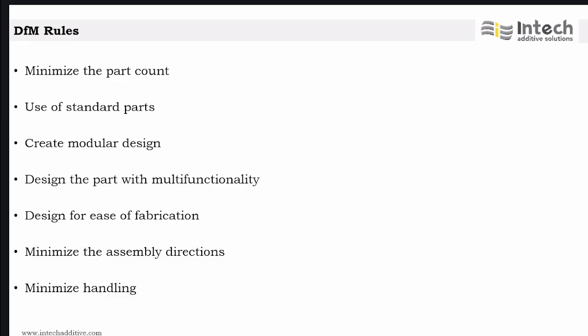And then next is about creating modular design. It's about building modules or blocks. Each module can be manufactured and tested. So if any of the modules fails, it can be swapped or replaced. So you'll have that flexibility.